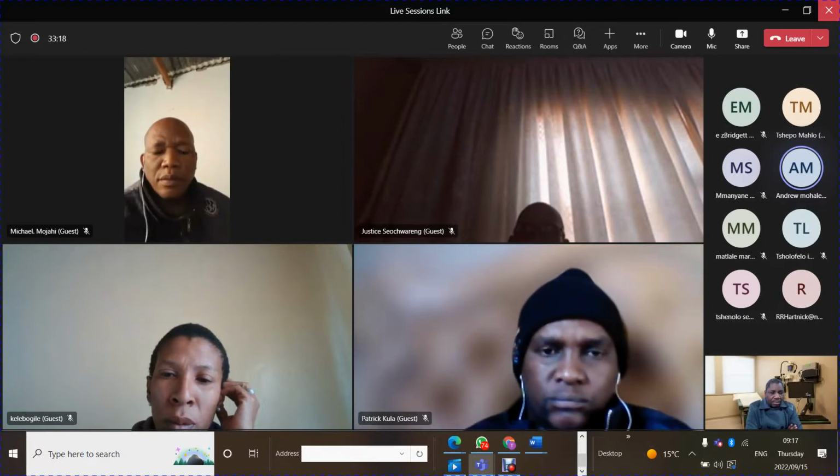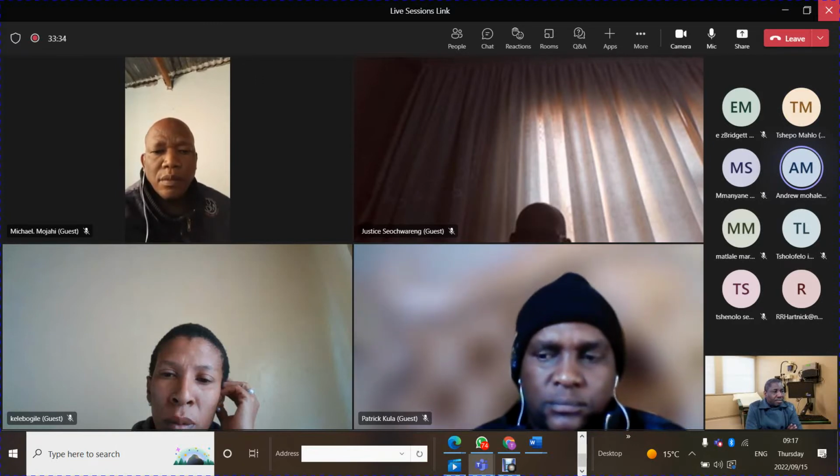So my question is, when I was going through that session, it says the light, I think it's the red light or the infrared light that is in the probe, is recognizing arterial blood by pulse motion.